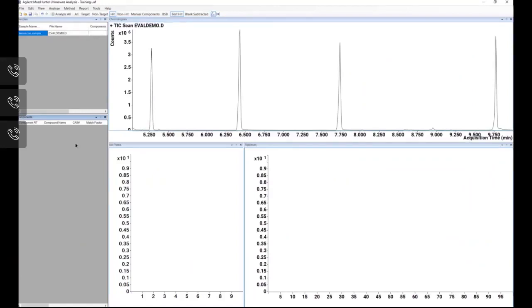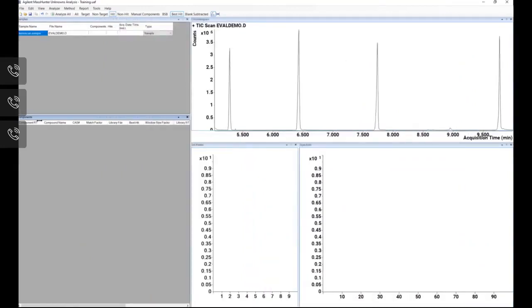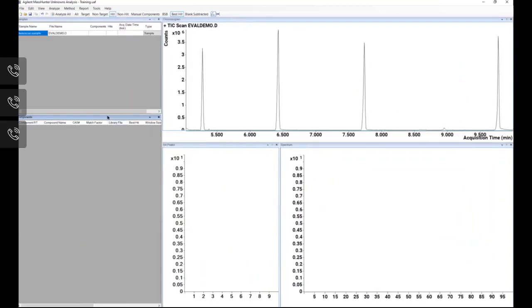The other thing that I want to point out is that you can move windows around. Again, going to that double arrow, I'm moving my cursor to the edge of the frame of the window. I'm left clicking and dragging, so I can move them back and forth, dragging to expose different levels of my tables on any window. I'll be doing this during the training: I will put my cursor and click on the menu bar, right click, and another right click menu pops up and it says hide or float. If I float it, it basically releases it.